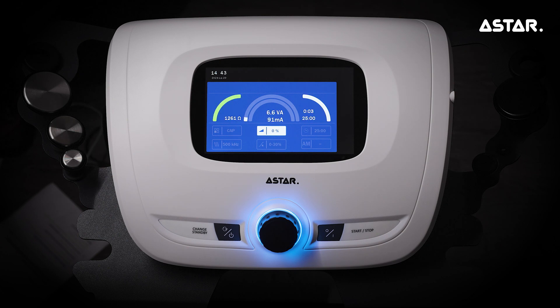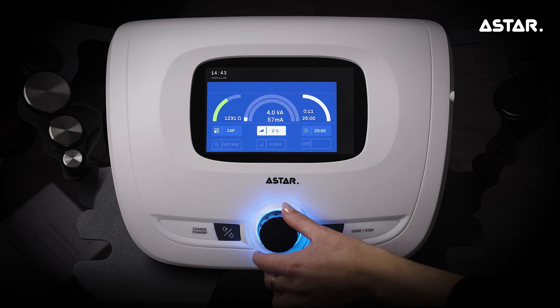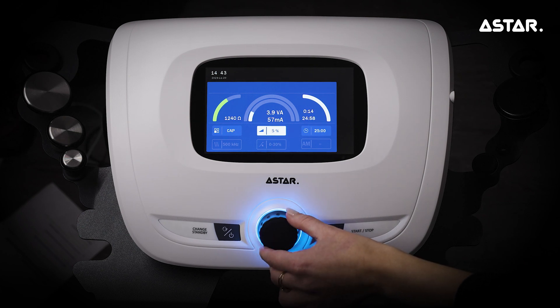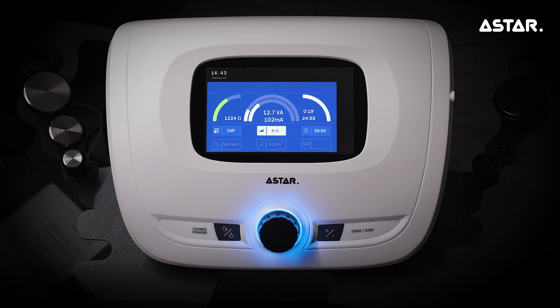Calibrate the active electrode — place it on the patient's body and wait for the acoustic signal to stop. Adjust the power level using the knob. The adjustment of this parameter depends on the treatment effect you wish to achieve and on the patient's feelings.